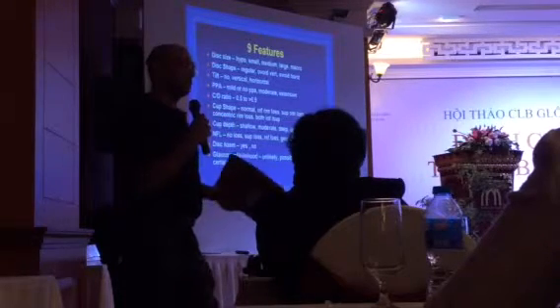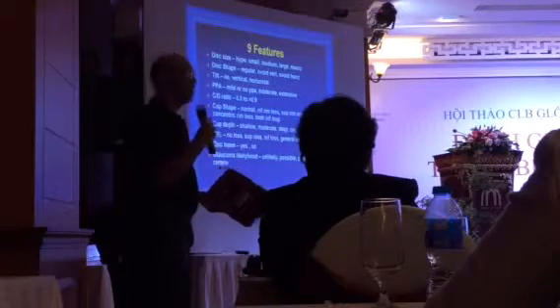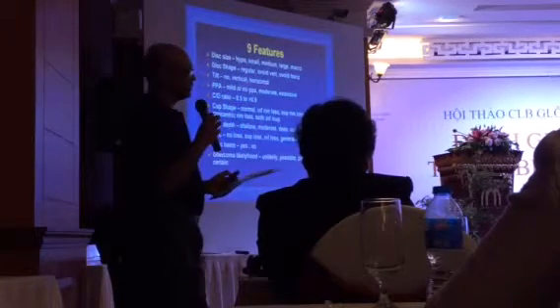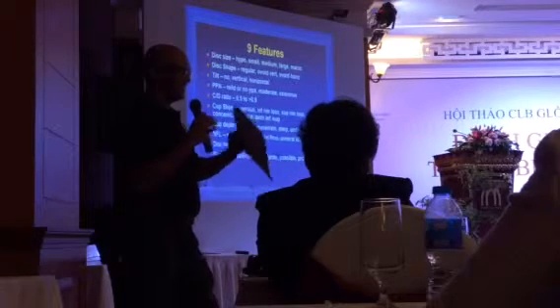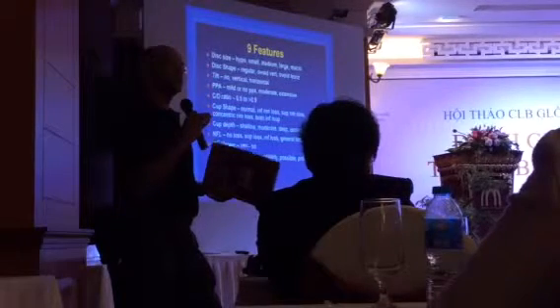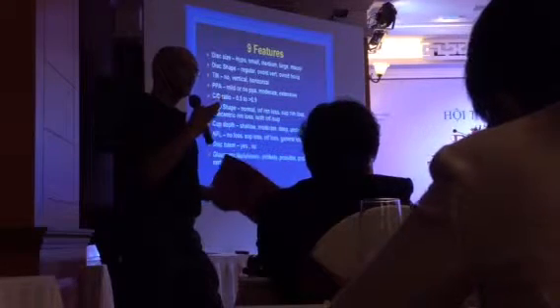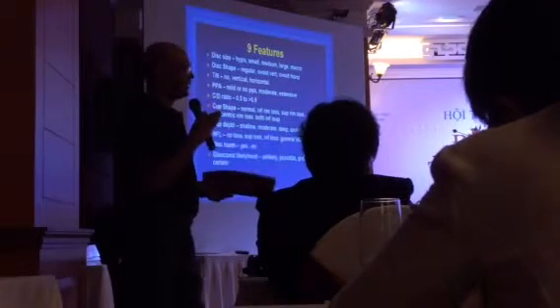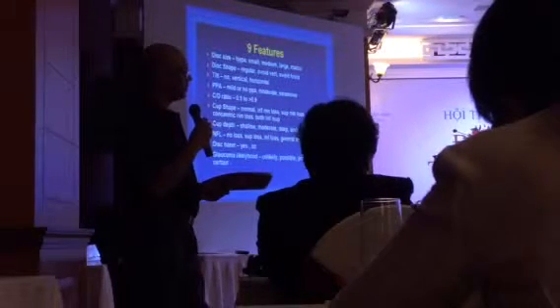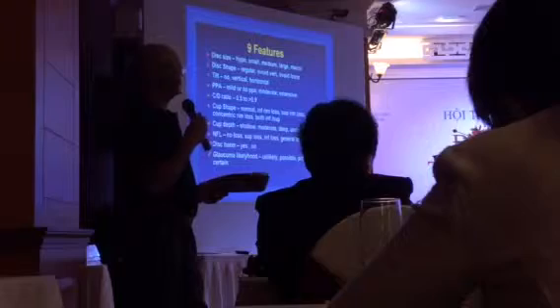Again, nerve fibre layer loss, as said, is really better seen on red-free. It can be very difficult sometimes on a photograph. With a bit of cataract, it can sometimes be hard to see nerve fibre layer loss. And quite often, if you've just got an image of the disc and only the immediate surrounds, you may not see the wedge defect of the nerve fibre layer. It's only when you see the arcades that you can see the wedge defect much more easily because it's much wider, and you have that comparison with the surrounding nerve fibre layer that isn't lost. Then disc hemorrhages, yes or no, and then the likelihood of glaucoma, with 4 options there.